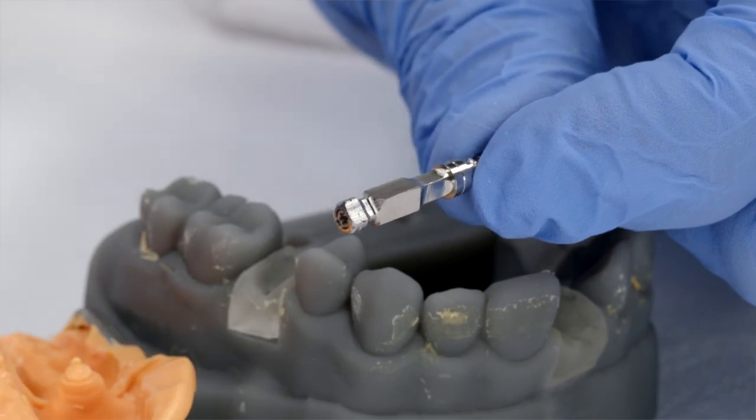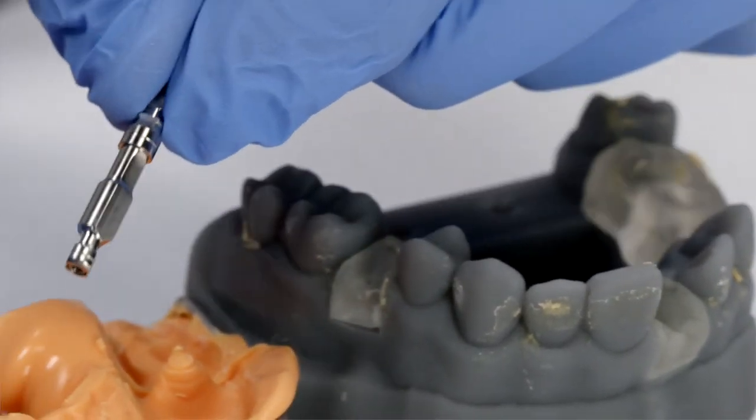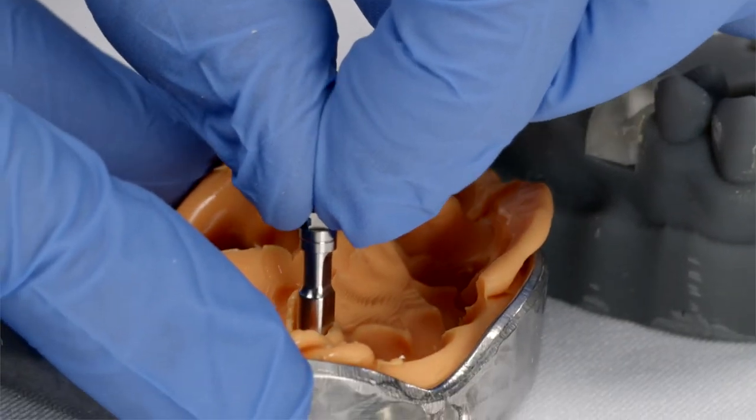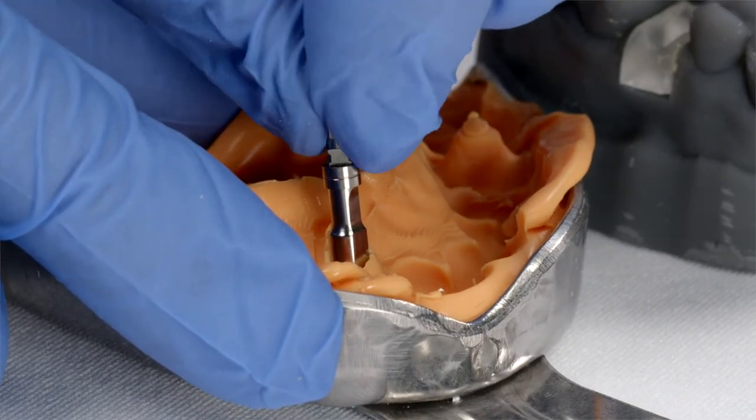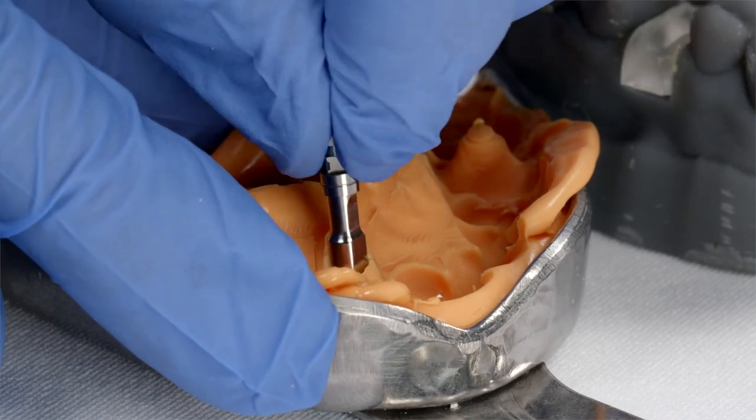Using the analog as a holder, the goal is to find the same position that was used with the plastic cap. Once engaged, rotate to see if there is any freedom. This means that the plastic cap was found inside the impression.